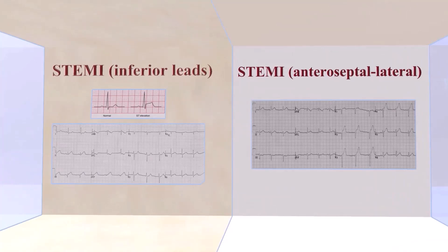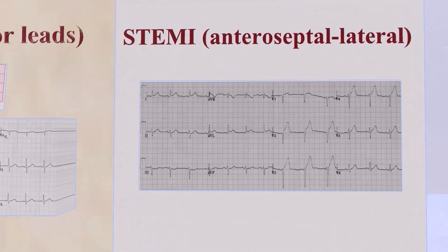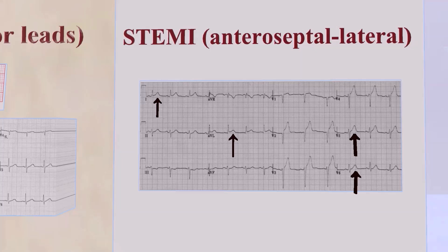In contrast, here we see an anteroseptal lateral STEMI. Anteroseptal means changes in V1, V2, V3, V4; lateral means leads 1, AVL, V5, V6. Looking at the ECG, we see ST segment elevation in V1 through V6 — so we're talking about an anteroseptal myocardial infarction that also includes the lateral leads, making this an anteroseptal lateral ST segment elevation myocardial infarction.